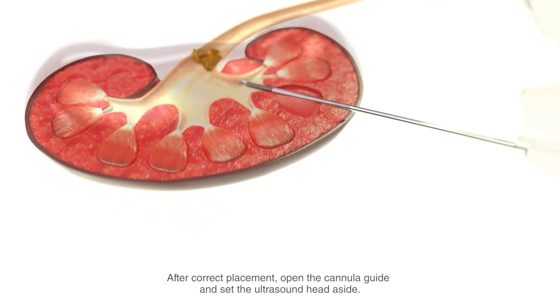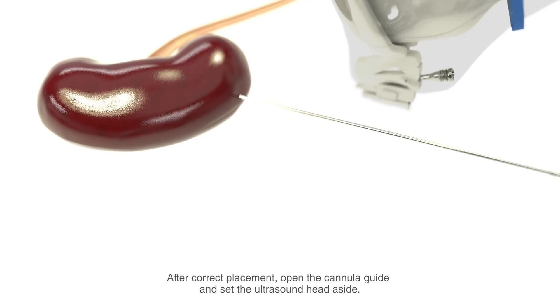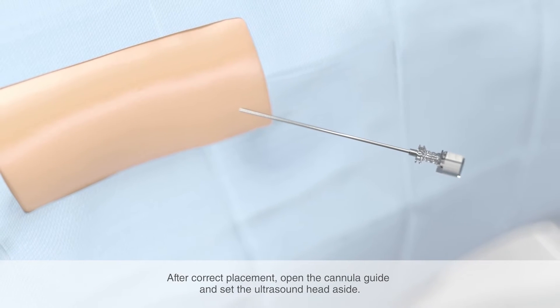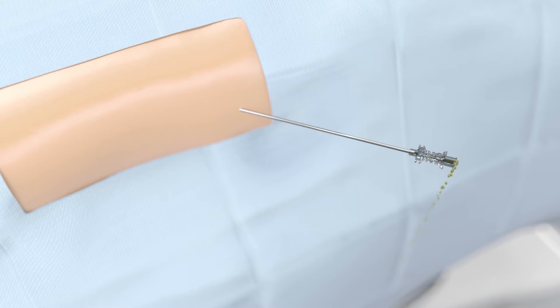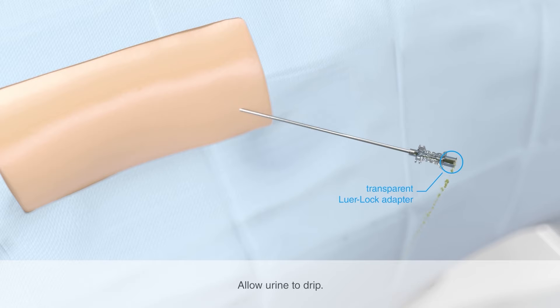Once the puncture cannula is correctly placed, open the cannula guide and set the ultrasound head aside. Remove the clip on the puncture cannula only after successful puncture so the inner cannula does not slide out prematurely. Pull the inner cannula out of the outer cannula. Ensure that the outer cannula remains in the body. In addition to checking the position using ultrasound and/or x-ray observation, drain some urine through the Luer-lock adapter.